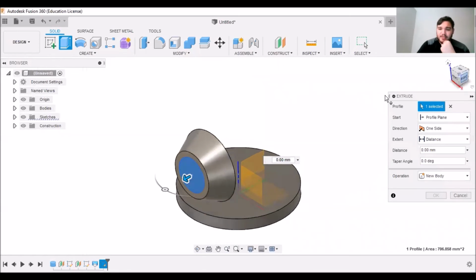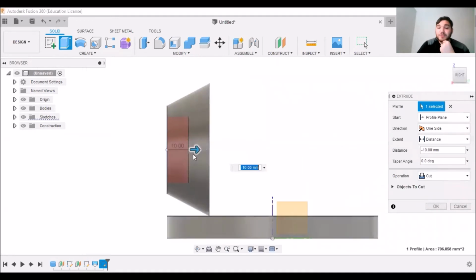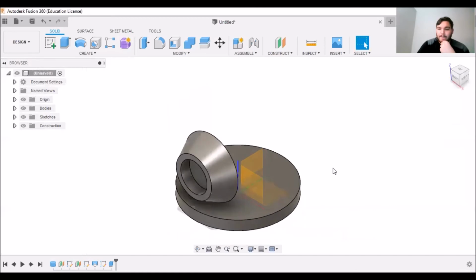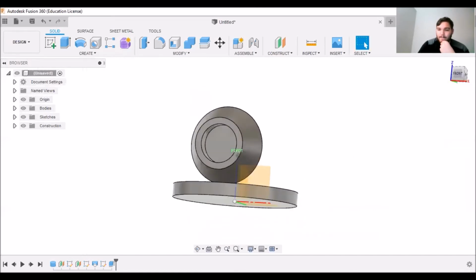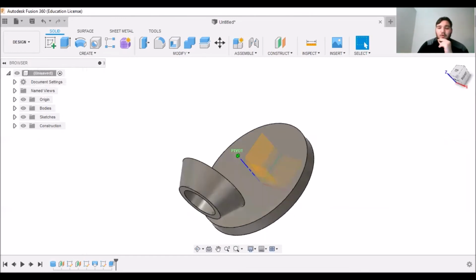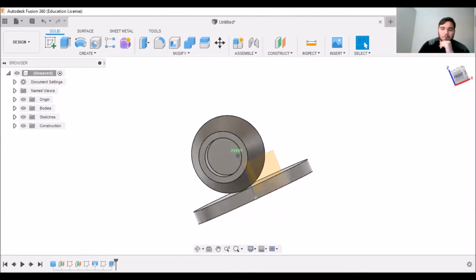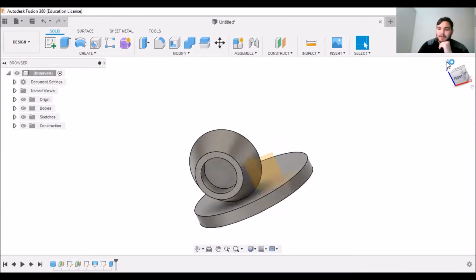And then we can actually cut into the cap a ways so that we can have room for screws, or room for bolts. And then once you feel okay with the cut, you can press OK. You have a little cap. And again, if you wanted to make another smaller circle, actually bridge the hole, perfectly fine as well. I think it'd be better, but this is just for the time being.